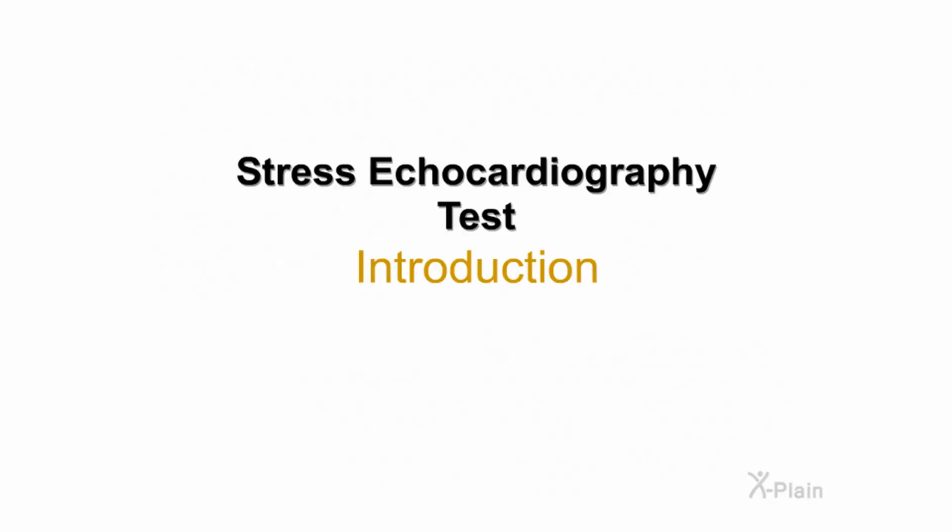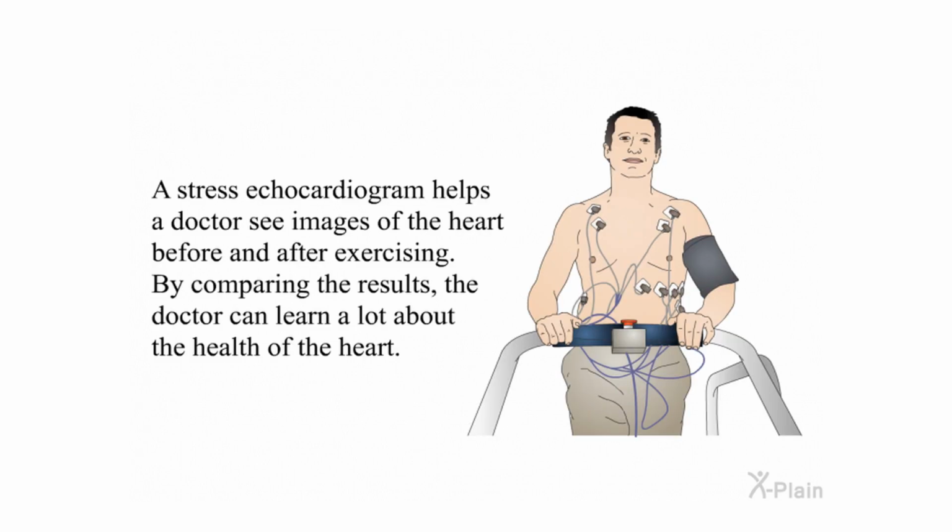Stress Echocardiography Test Introduction. A stress echocardiogram helps a doctor see images of the heart before and after exercising. By comparing the results, the doctor can learn a lot about the health of the heart.